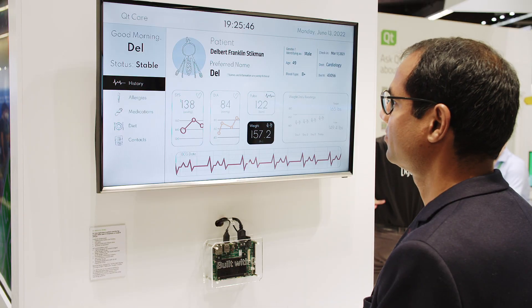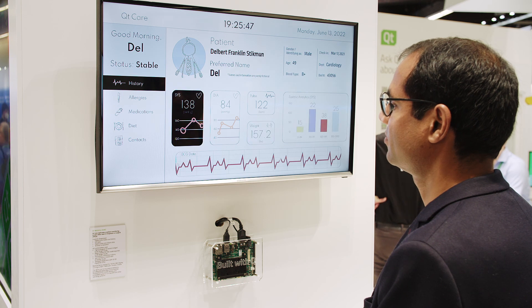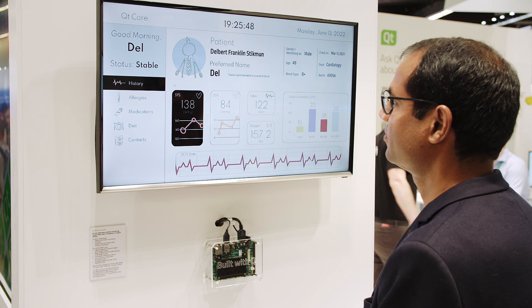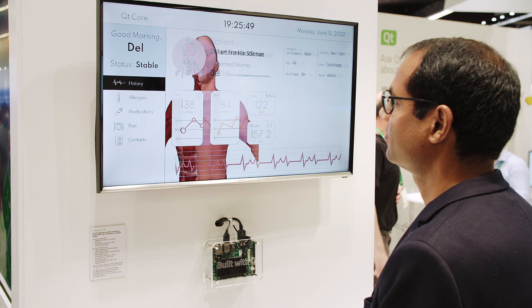This is a medical device demo running on the IMX8 device, showing Qt in the medical industry. It demonstrates the integration of 2D graphics and 3D models in the same application. This demo also shows that Qt can be used on Linux or another RTOS like QNX or VxWorks.